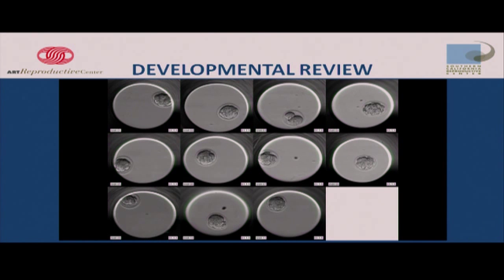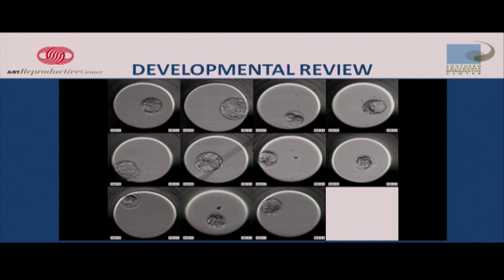But we look at these things, and they advance along, and we track every single one every single day, and we look at every picture to see if we can ever catch a problem. We look at this whole set of 11, and we knew which ones were the better developing ones and which ones weren't by analyzing how each one developed across each time point. We then can use some of what the literature has found, and some people who have a lot of time-lapse experience have found out that there's a number of ways to segregate which embryos are the best and such.